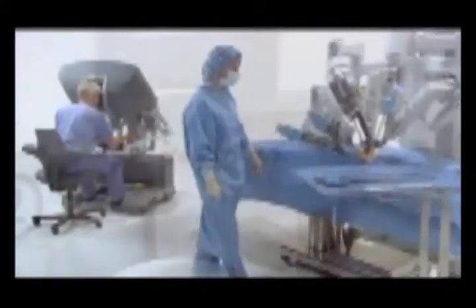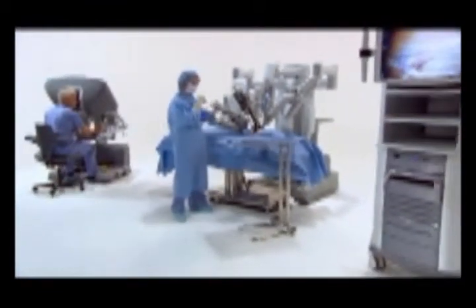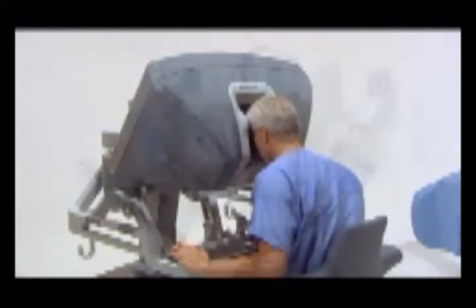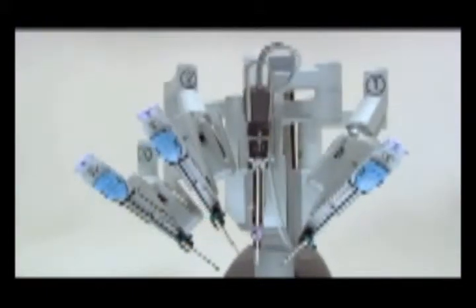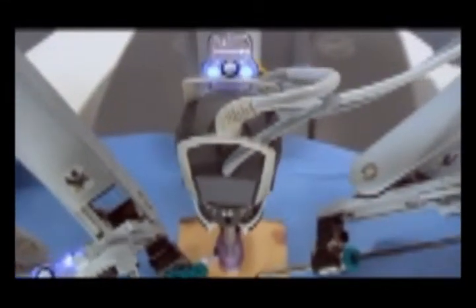The most advanced surgical platform available in today's market, the da Vinci system consists of an ergonomically designed surgeon console and a patient side cart with four interactive robotic arms, one to hold and position the high-resolution stereo endoscope.